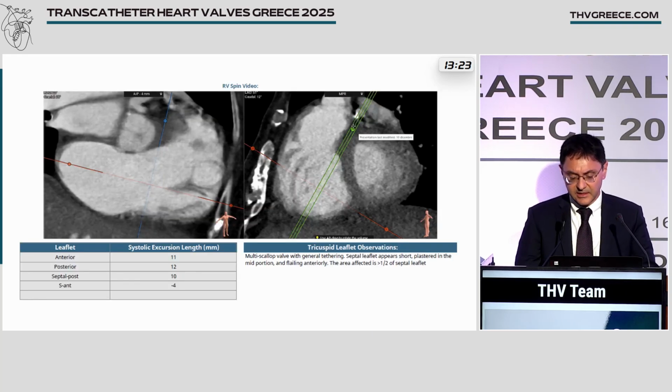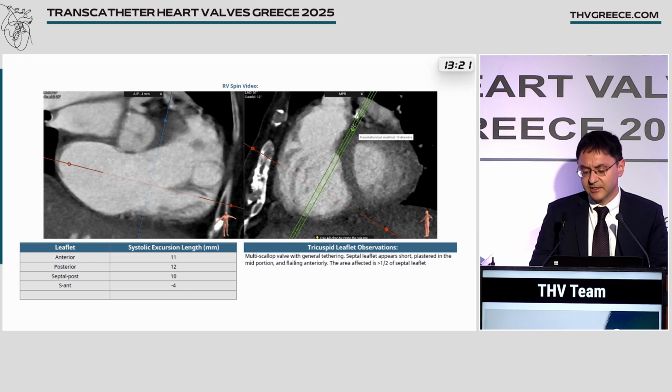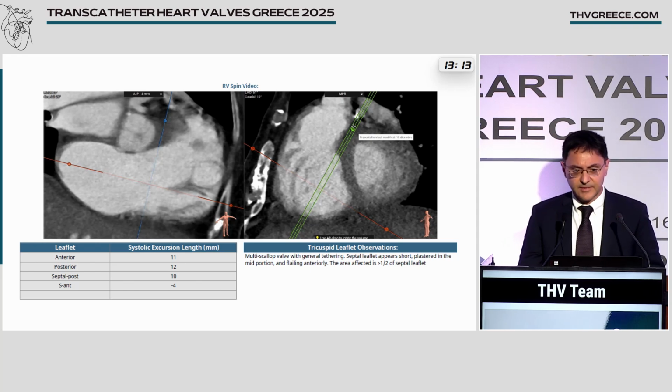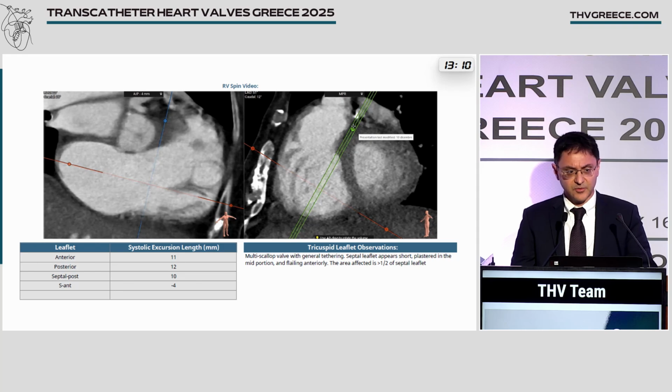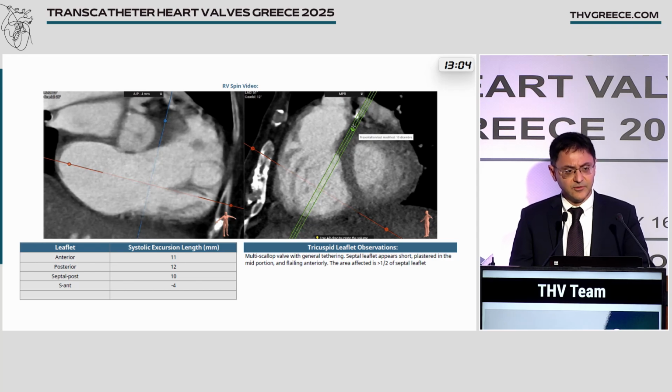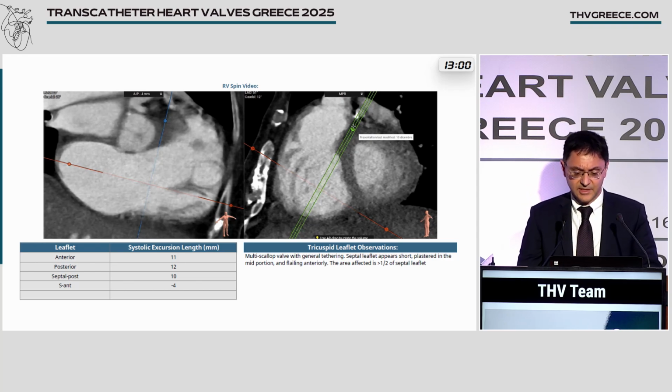the CT assessment. As we said, it is crucial to assess such patients with CT when we plan to proceed with the Lux-valve, since there are specific characteristics. For example, we have a minimum diameter of the internal jugular vein, brachiocephalic vein, of 8 millimeters.